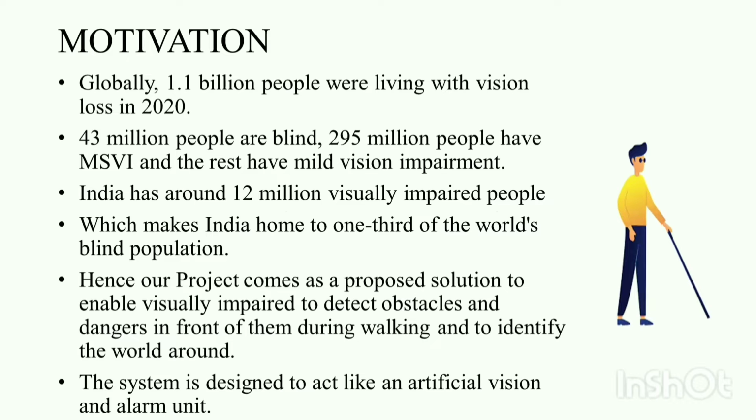Hence, our project comes as a proposed solution to enable visually impaired people to detect obstacles and dangers in front of them while walking and to identify the world around. The system is designed to act like an artificial vision and alarm unit. Now I hand over to Priyanka.